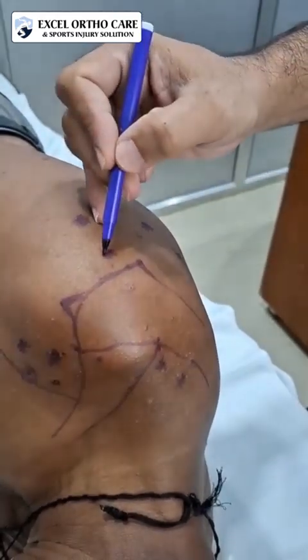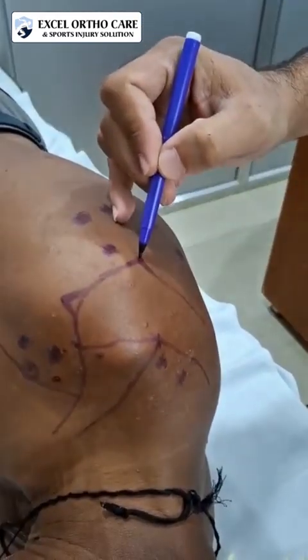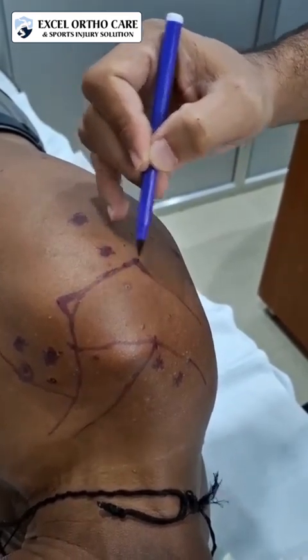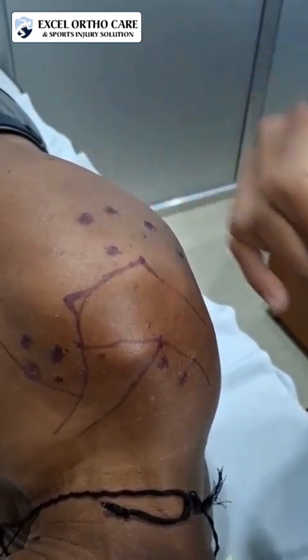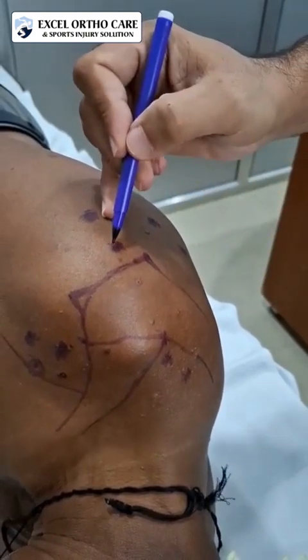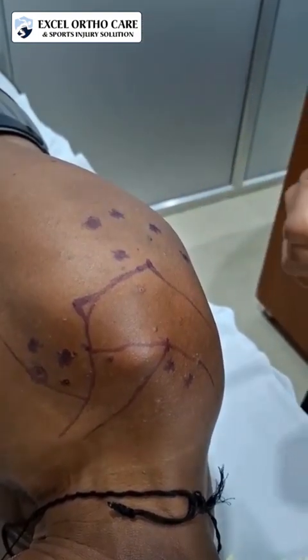Another important portal is the port of Wilmington. It is 1 centimeter lateral to the edge of the acromion and 1 centimeter anterior to the posterolateral corner of the acromion. This port of Wilmington is used for anchor placement in case of SLAP repair.